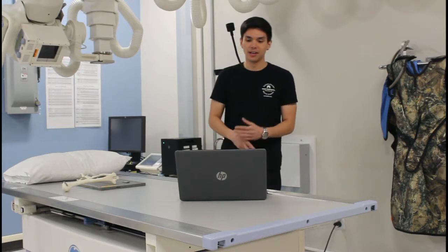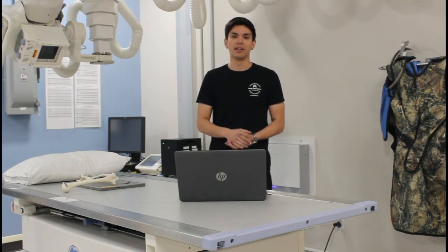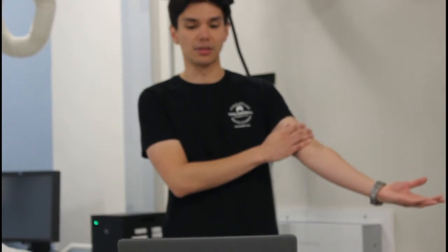Hi again everyone. So the reason why we would be performing this examination, the Coyle method, is typically when there's a suspicion for a radial head fracture. With that being said, the suspicion would be caused by an inability to rotate or supinate the hand, difficulty fully extending or abducting the arm, and then if there is a history of elbow trauma, which would cause swelling in the elbow joint and pain outside the elbow. These injuries are most common when a patient tries to brace their fall forward, cracking the radial head.